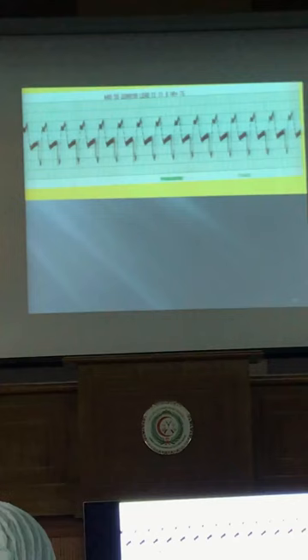What does this other rhythm mean? It is the same as the previous but with a controlled rate. Why is the rate controlled or normal? Because a pacemaker device was adjusted — there is a spike here. A pacemaker is an artificial device generating electricity, with a wire inserted transvenously and applied to the ventricle. It conducts electricity to pace the heart. You find this spike, which is the generated electricity, then the ventricle captures. This is the pacemaker rhythm. We have finished the ECG recognition.